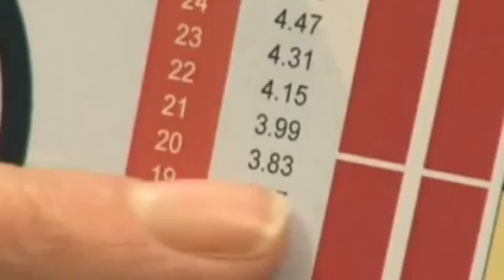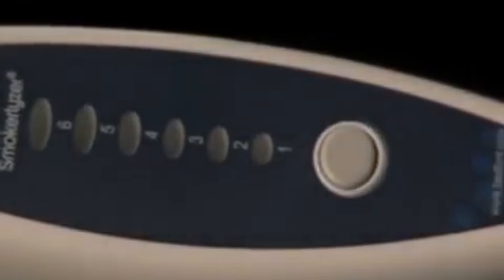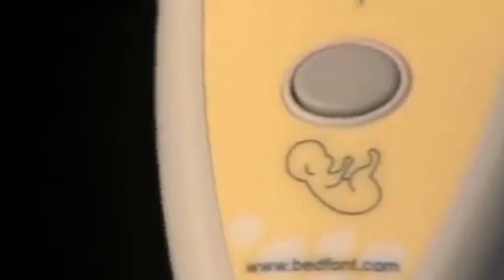Results are instantly available on screen and can be easily interpreted using charts supplied. Clinical studies indicate a close link between the level of carbon monoxide in an expectant mum's breath and the level in her unborn baby's blood. Some of Bedfont's Smokerlyzer products are specially designed to show the amount of CO being transferred from the mother to her unborn child.